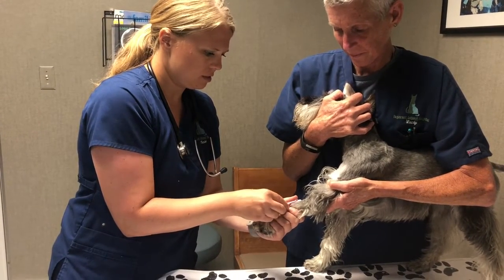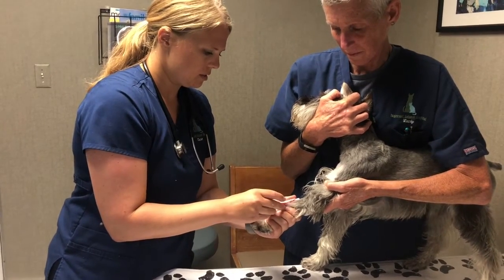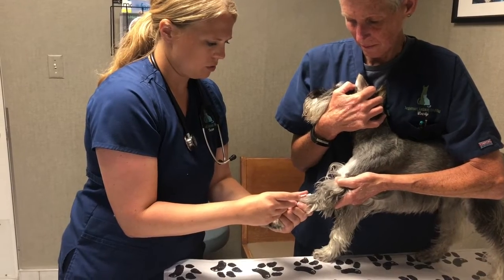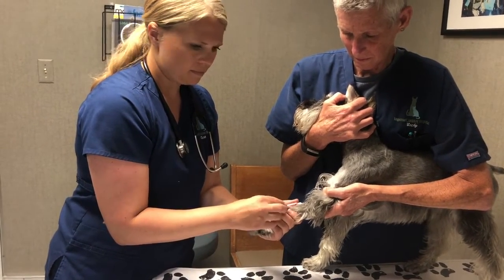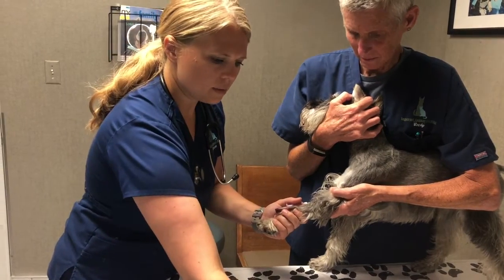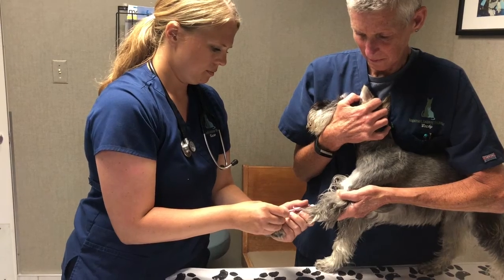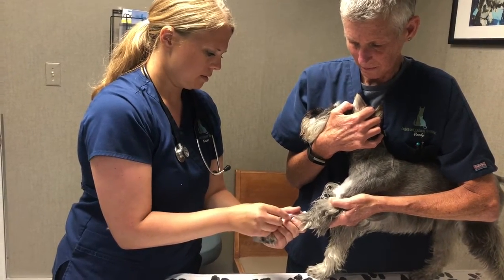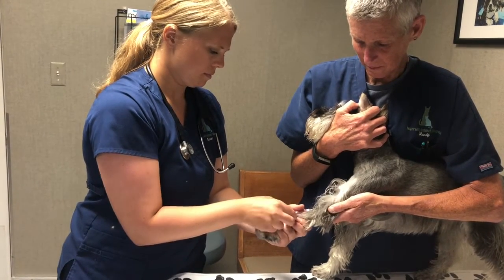There's my flash. And insert it in the tube. And it'll draw up about 2 milliliters of blood. I'm going to start my timer.